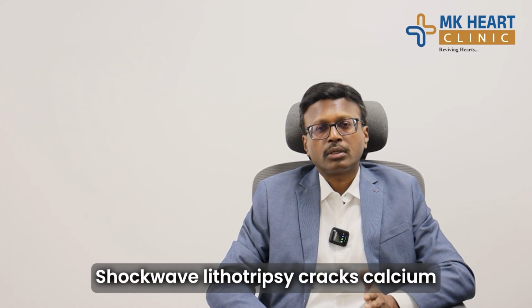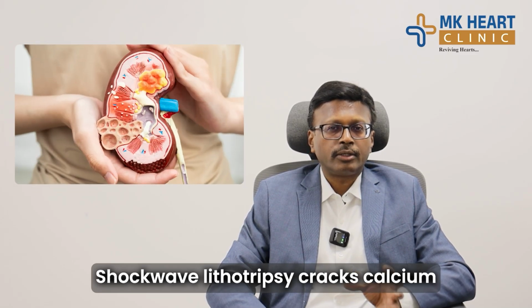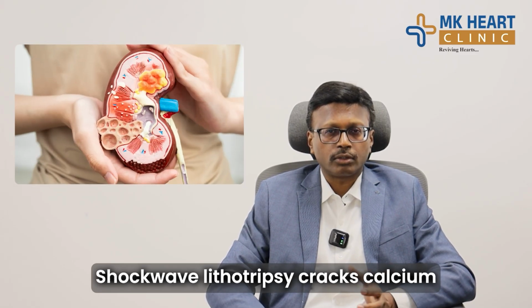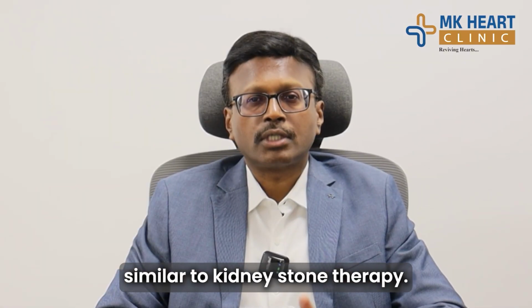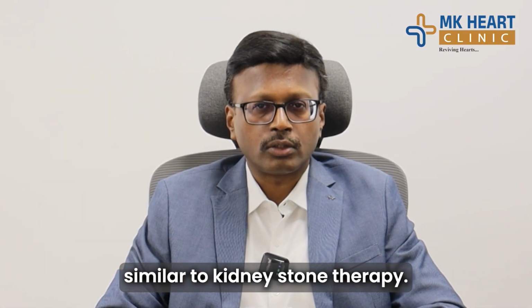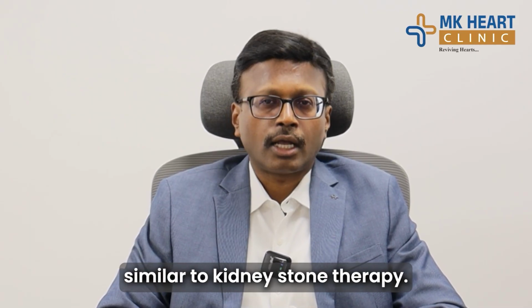And then the fourth important treatment is called intravascular shockwave lithotripsy. This is called shockwave treatment. Traditionally, the lithotripsy treatment is used for renal stones, where the shock waves will break the stones into smaller fragments. Now, the same treatment is available in coronary arteries also, where we can break the calcium. So these are the 4 important ways of modifying the calcium.